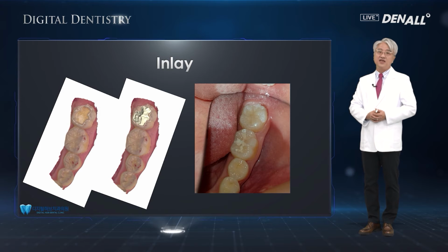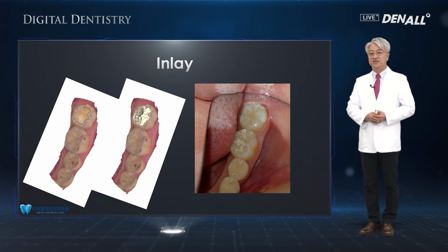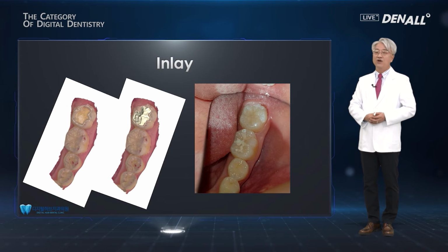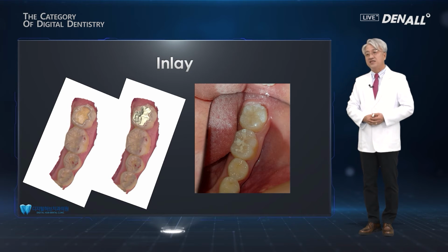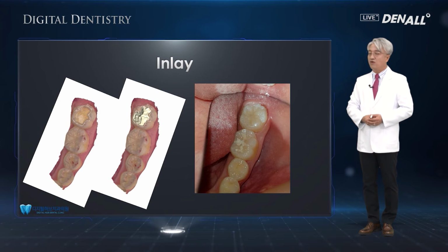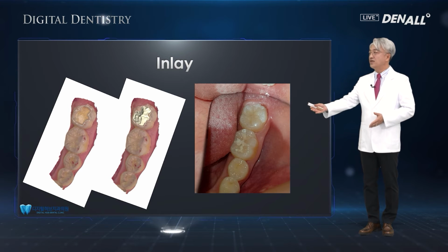Now, in the past lecture, I talked about one-day inlay, and in this lecture, I will also briefly mention inlay. As you can see, with the CAD, the inlay was designed, and as I explained, third generation hybrid ceramics was used for milling and then delivered to the patient.